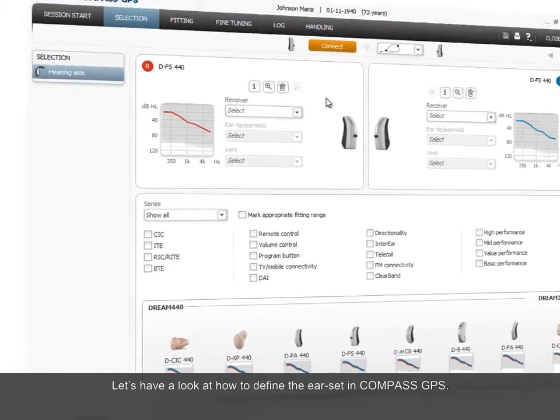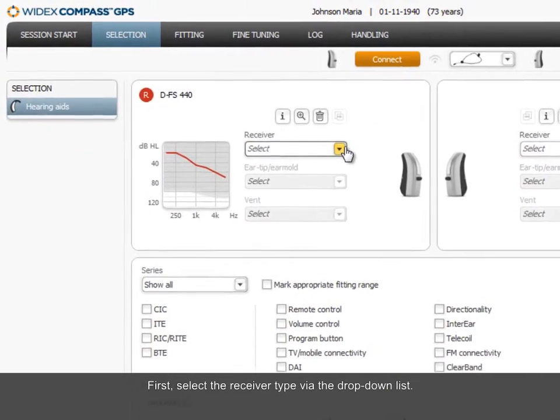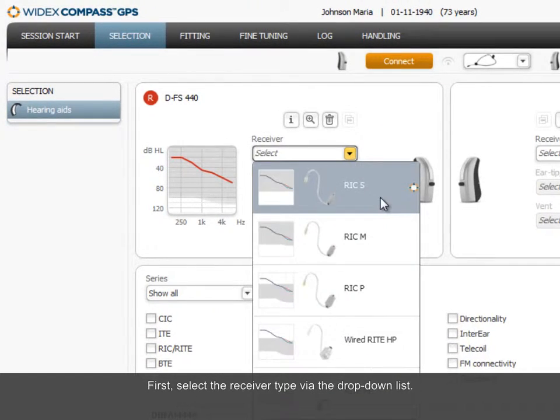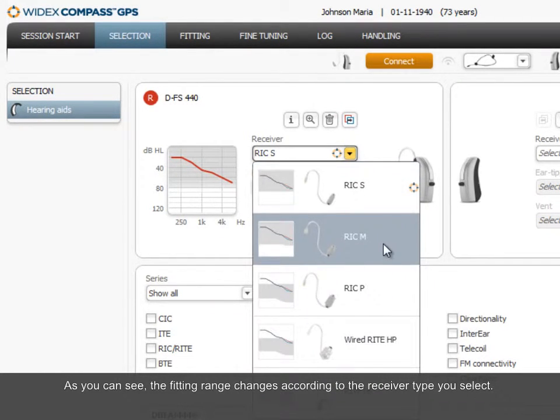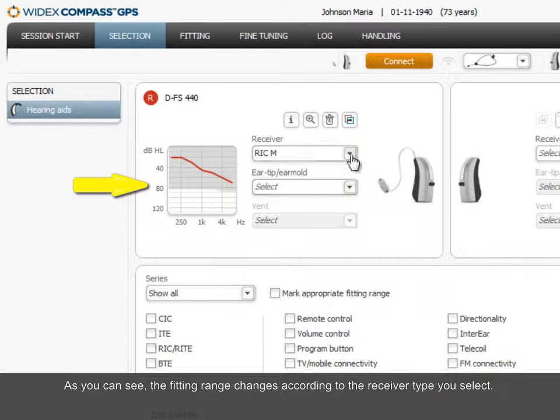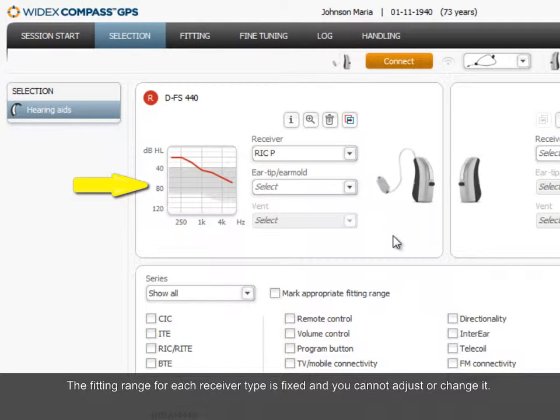Let's have a look at how to define the ear set in Compass GPS. First, select the receiver type via the drop-down list. As you can see, the fitting range changes according to the receiver type you select. The fitting range for each receiver type is fixed and you cannot adjust or change it.